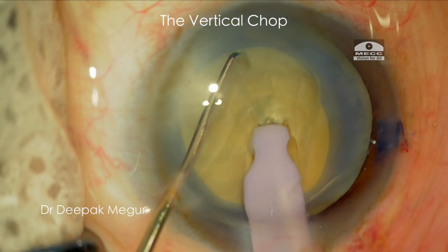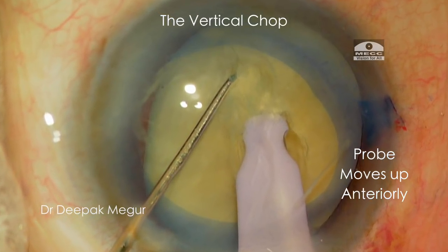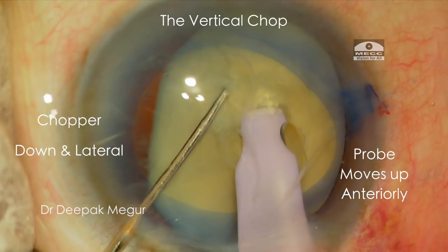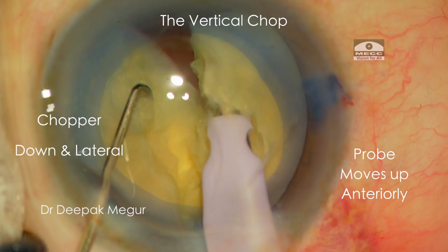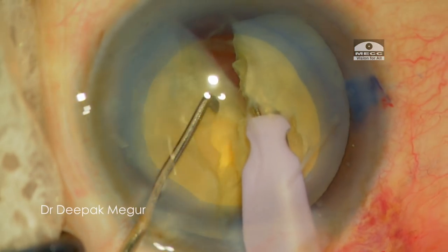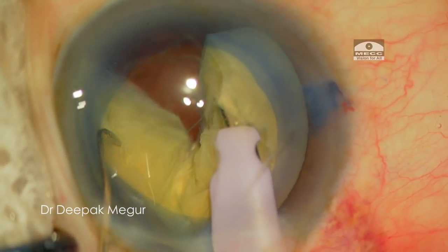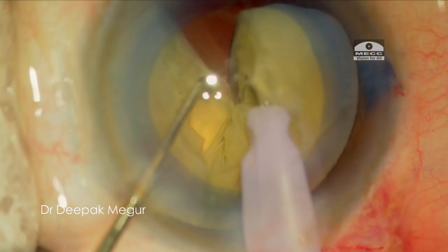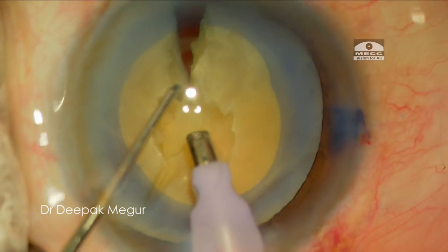So once I bury my phaco tip, my right hand moves up a little bit ensuring the nucleus lifts up a bit. Simultaneously, my left hand with the chopper goes vertically down and then laterally. Once the crack is noted, I keep my right hand steady, pulling the nucleus ever so slightly up while my left hand is performing the lateral separation, gently repeating it at progressively deeper planes. At this moment, only a part of the entire nucleus is cracked, but it is fine — I am not in a hurry.